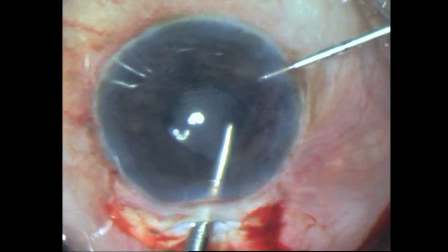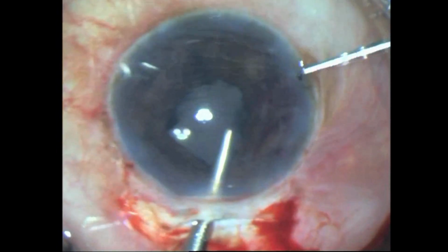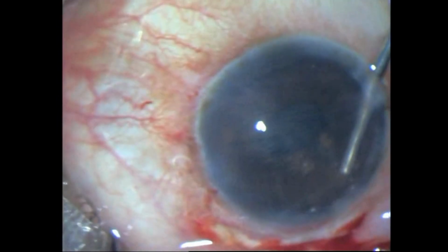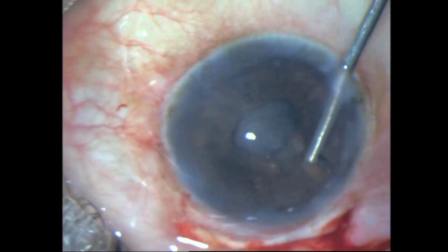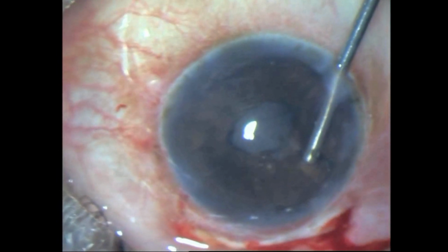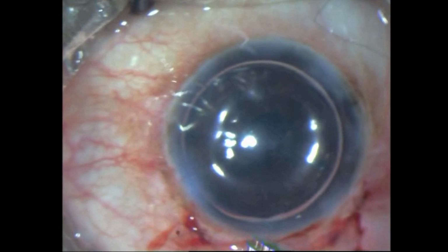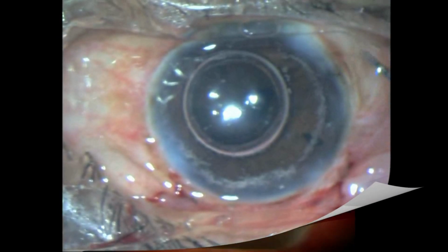And then I have done an iridectomy with my vitrector. You have to excuse the quality of the video, this is an old surgery, and I sutured the wound. Post-operatively he did very well. His vision was 6/6 with a minimal cylinder, and he has maintained it almost now 1.5 years, 2 years or more.